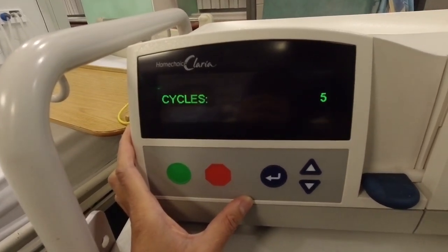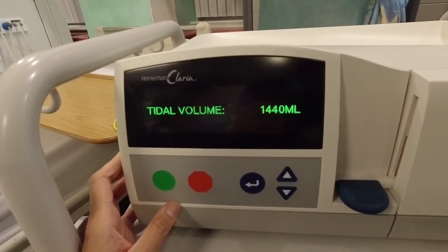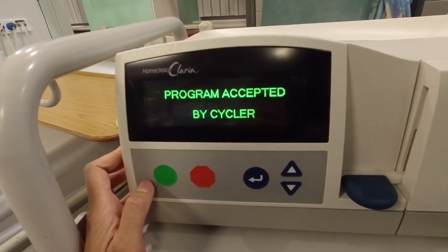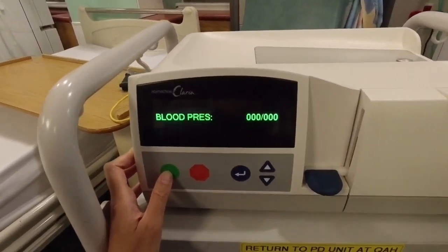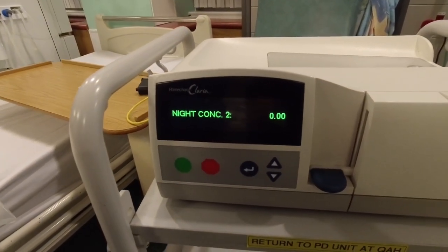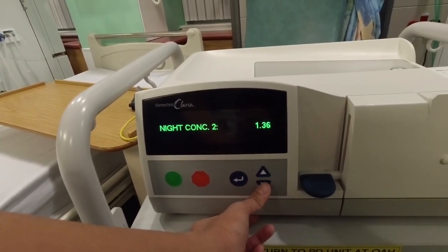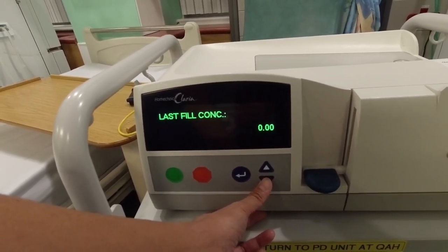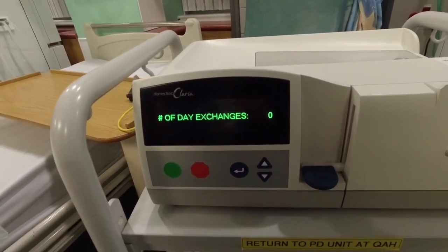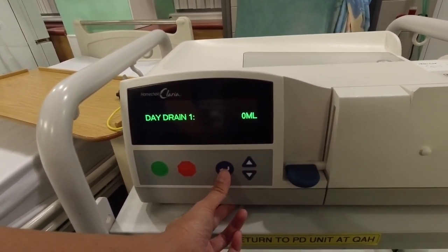It says cycles 5, and dwell time 1 hour and 25 minutes. Program accepted by cycler. There you go. Press the green button. No blood pressure. Night concentration, bent arrow key. Then enter, arrow down. Last fill, just enter. That's it.